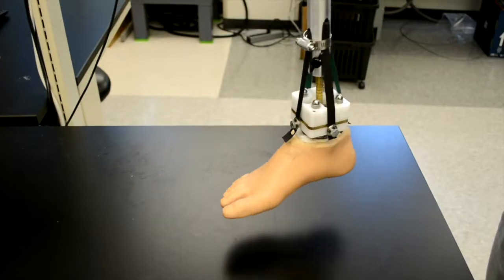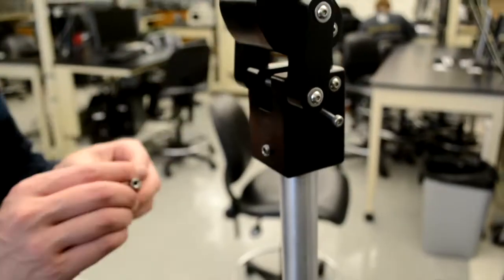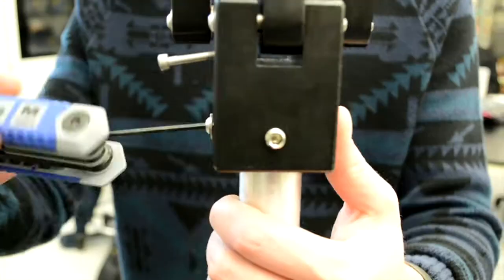The entire system weighs less than 2 kilograms, and the tension system provides 88% energy retention, ensuring long-lasting comfort for the patient — for under $50.